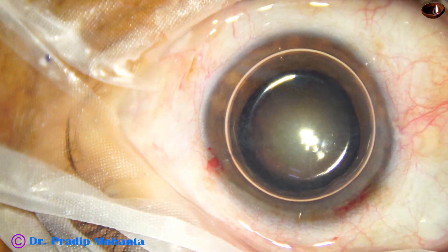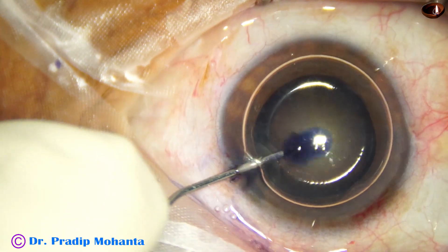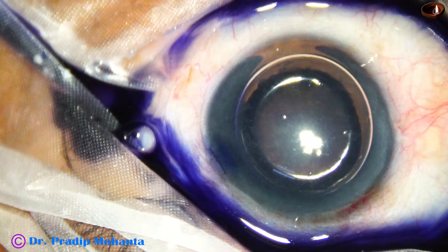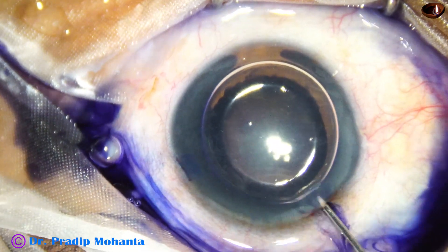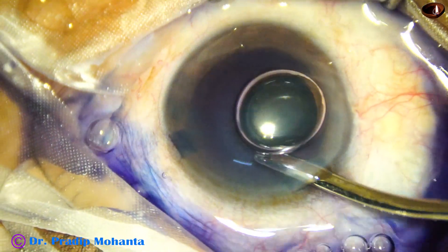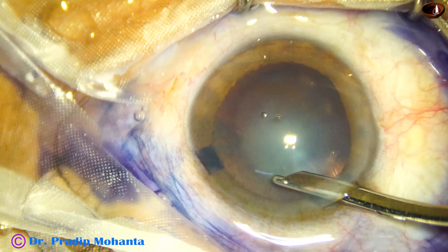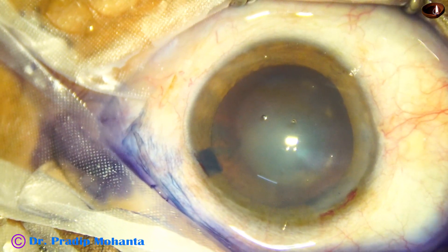An air bubble is injected. Beneath this air bubble, trypan blue dye is applied over the anterior capsule. A bit of adrenaline is used to maintain the dilatation of the pupil. The dye is washed out, as incidence of tears may be less if we wash out the dye.